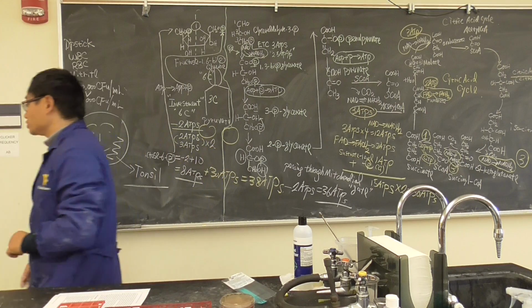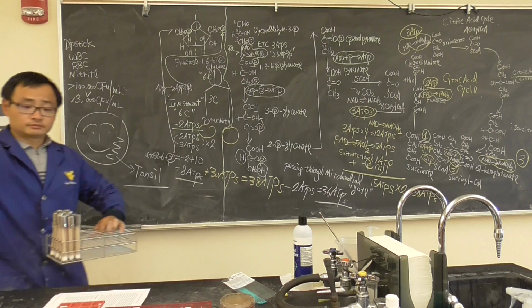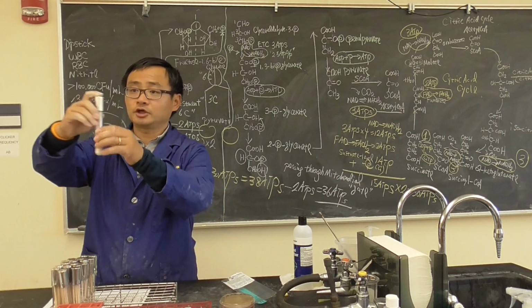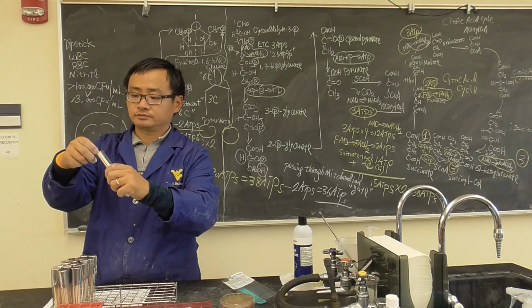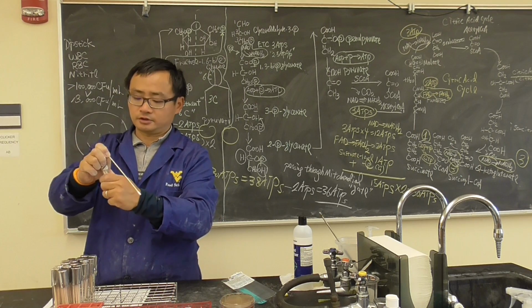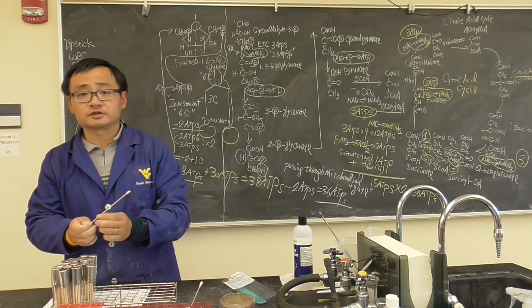We have these autoclaved cotton swabs right here. You're going to take one, okay? I'll just take one of that. Of course, I'll take 2, sorry. Of course, you have to wear the gloves.